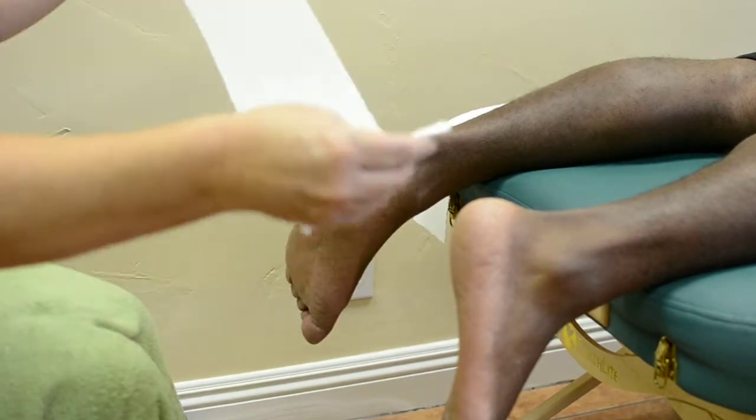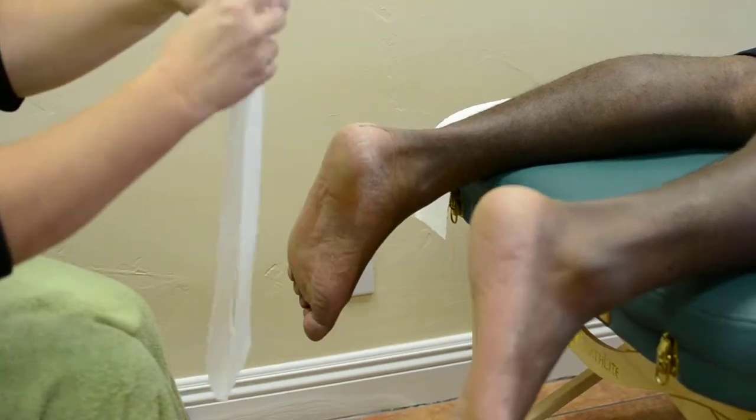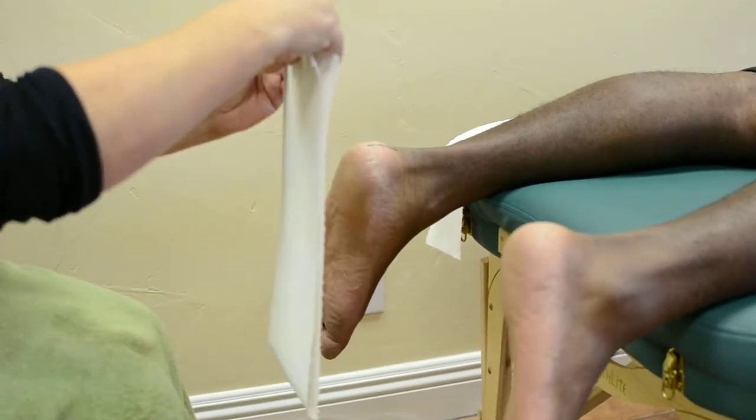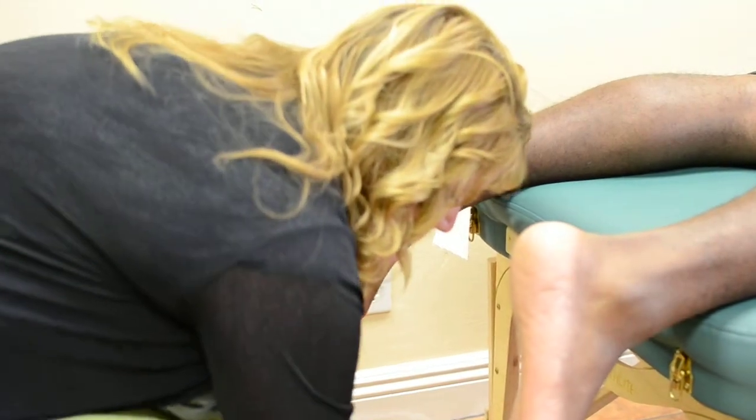So each of these is already cut. It's 5 by 30. So I take the two open ends and place them together so that I don't lose them in the water. Okay. Right. So then as you put it in the water, it just dissolves.